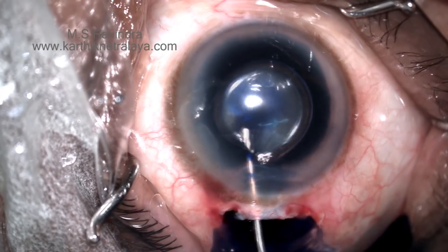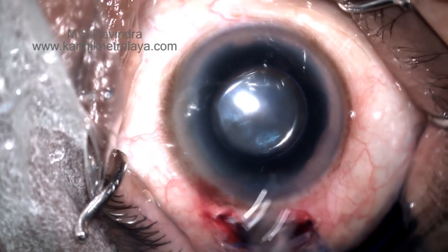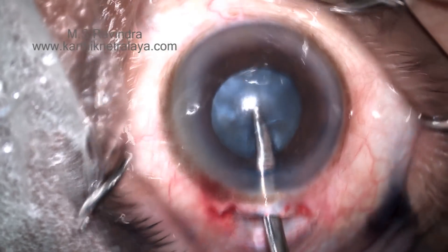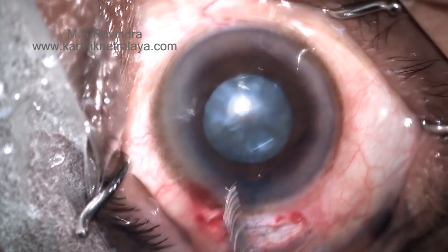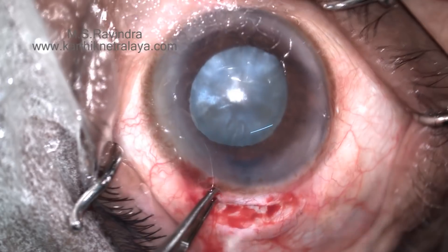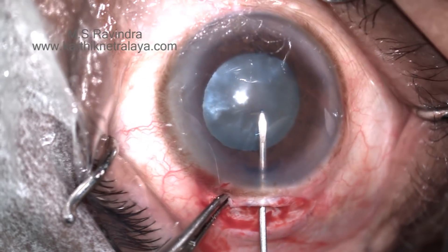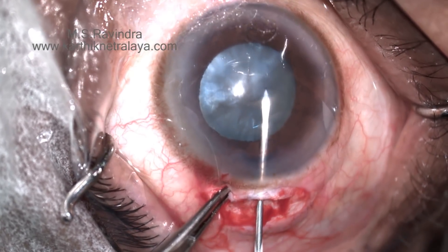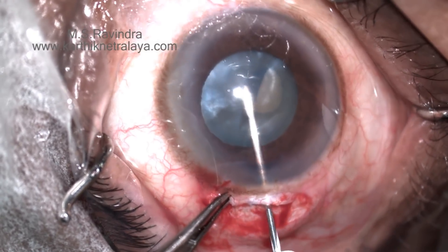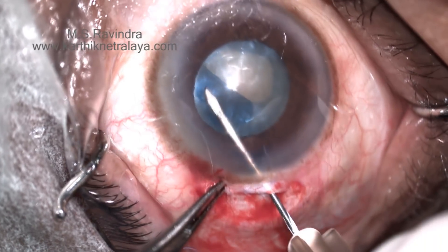A sclerocorneal tunnel is made. Entry into the anterior chamber is through a 3 mm keratome. Trypan blue is aspirated. Visco is injected into the anterior chamber to make it deep. The cystitome enters the anterior chamber through an entry in the floor of the tunnel, which keeps the chamber deep throughout the procedure.